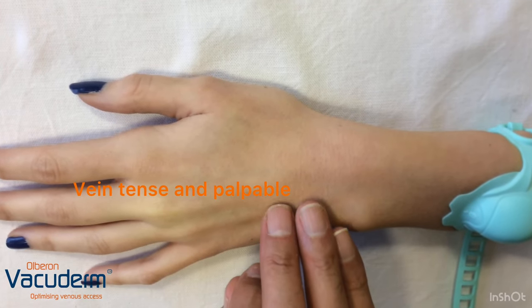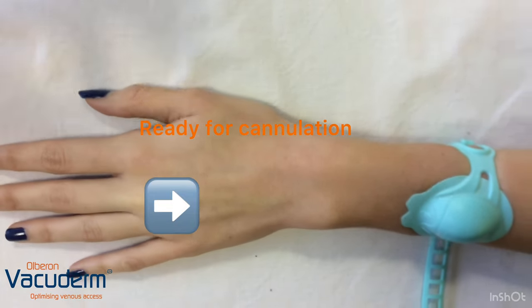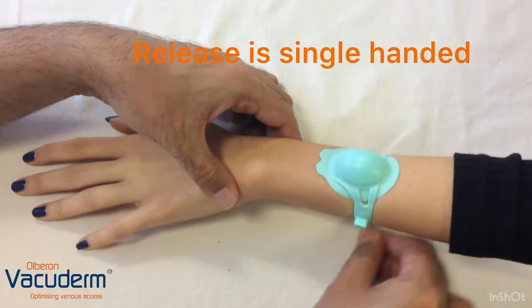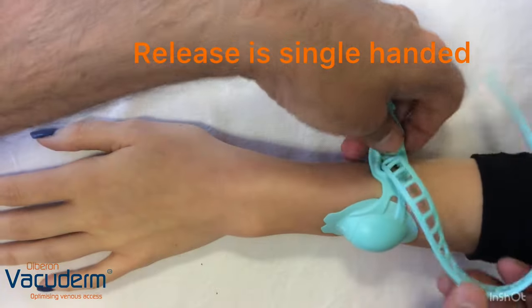This is quite tense and palpable and improved for cannulation. Once cannulation is performed, the release is also single-handed, to release from the buckle.